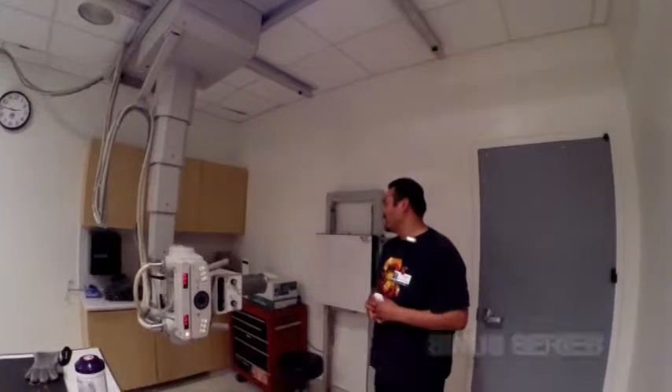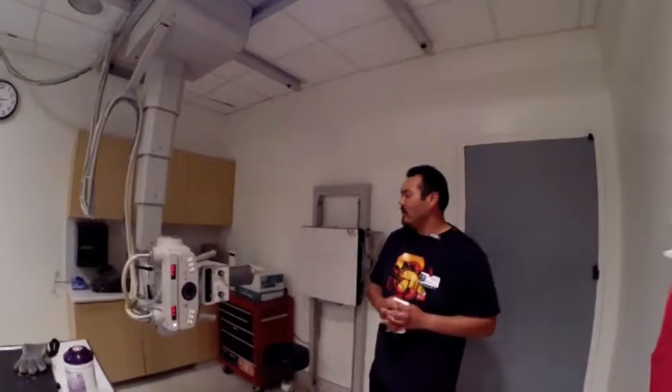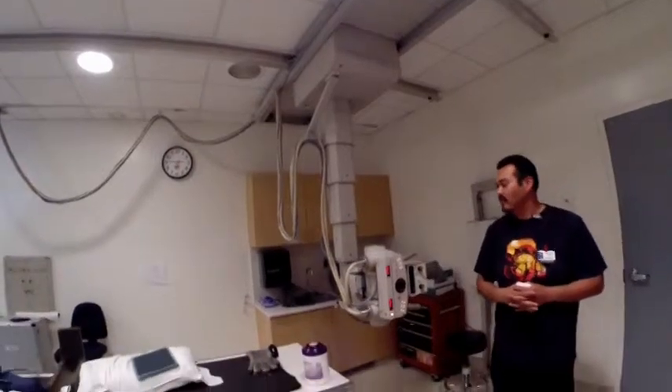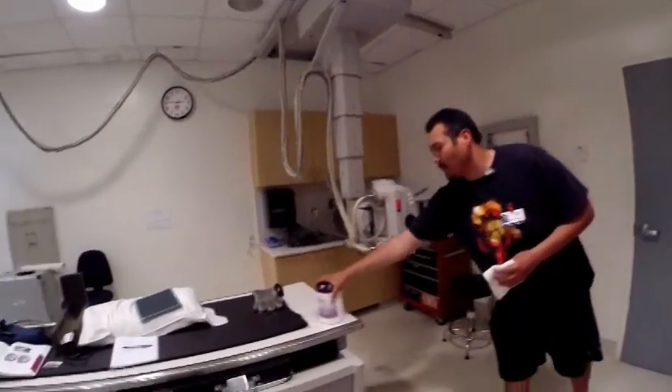Hello everybody, my name is Alfredo and I'm a radiology student at Santa Barbara City College. Today we're going to be showing you how to do a sinus series and also a mandible series. Let's go ahead and get started. We want to start out by setting up our room. We have our tube detented to 48 inches — you can do 40 to 48 inches, that's fine.